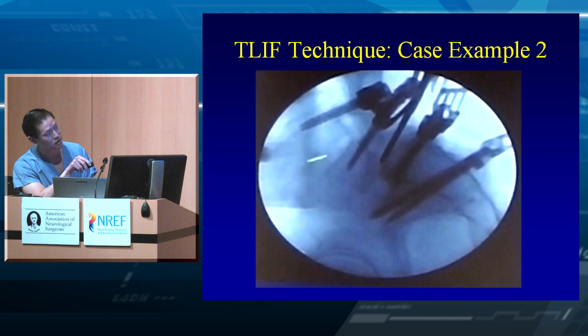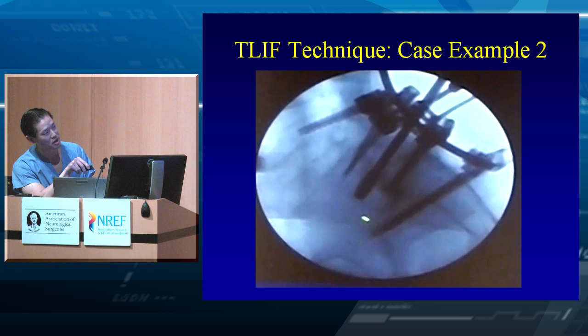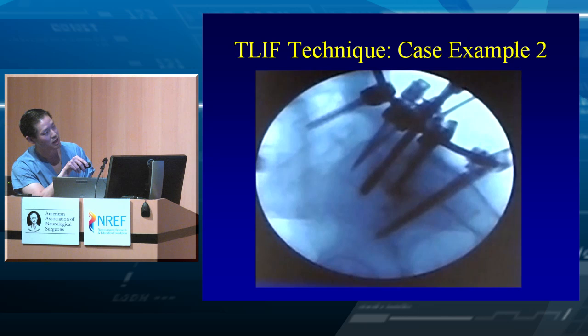But the osteotome goes in, and the segment's fairly mobile now. Then you put a paddle distractor in, you sequentially distract this, right? So you're getting distraction, you're pretty ventral here. Remember, the vessels are going to be in front of the L5 body. Then you can start to reduce. This is a reduction screw. And you're reducing it back, and you're improving this lumbosacral angle here.